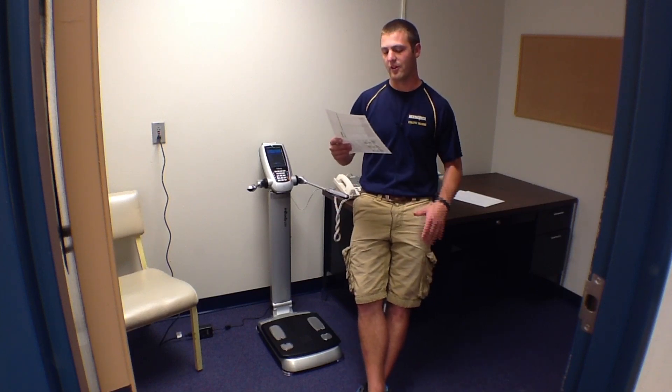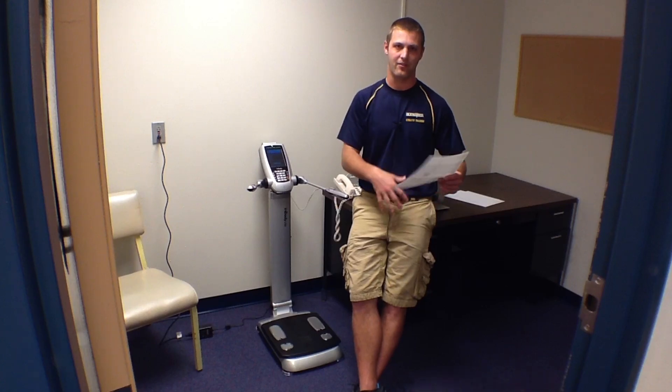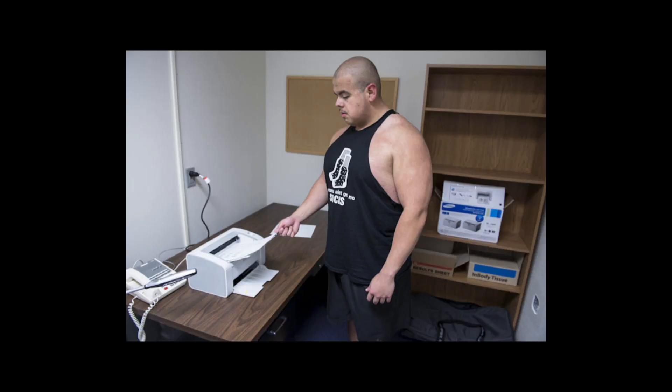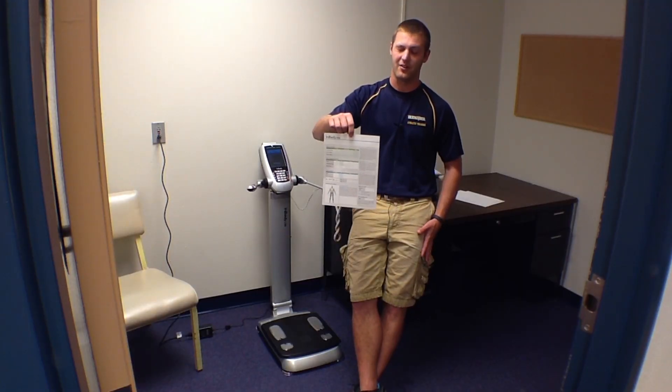You can also do a segmental lean analysis, which basically divides your body into four quarters: upper half right, upper half left, bottom half left, and bottom half right. Then it'll print it out on one of these nice little sheets so that you have it all accessible.